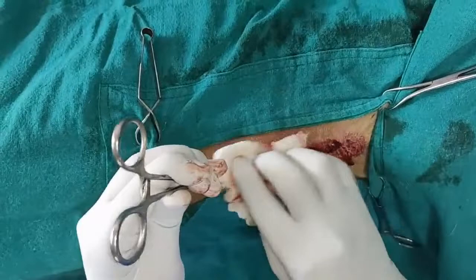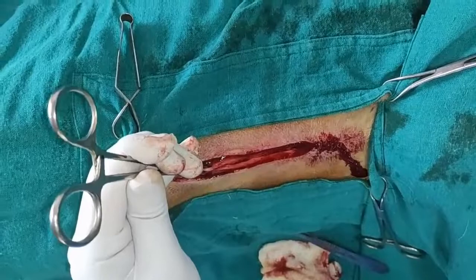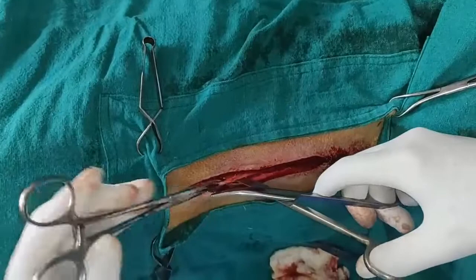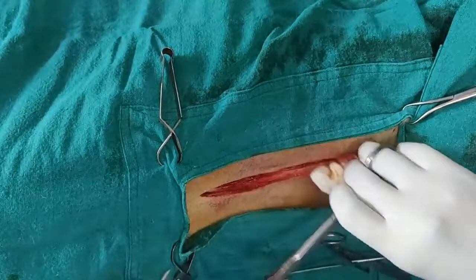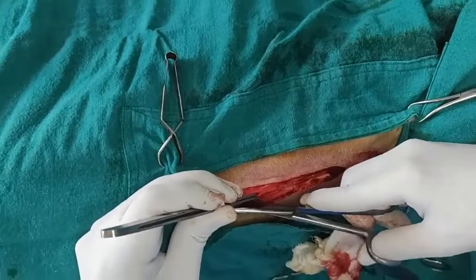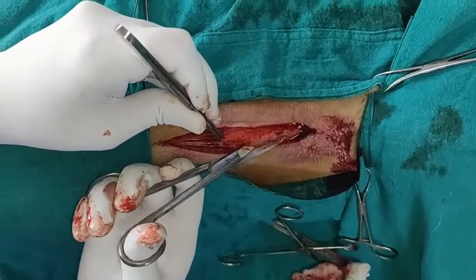So now this is the linea alba. See here, you will find the falciform fat below, and we open. So we extend the incision. Definitely electrocautery would be helpful here, but since we don't have electrocautery, my intention is to explore the abdomen also. That is why I am giving this incision.